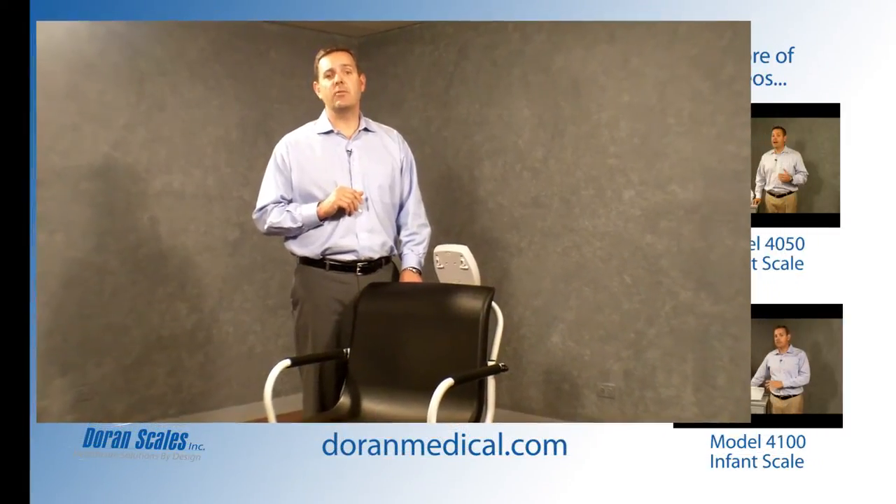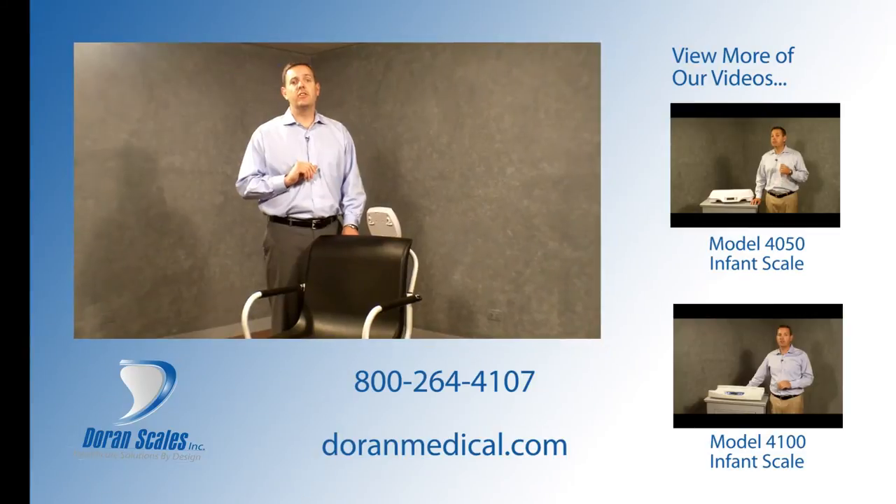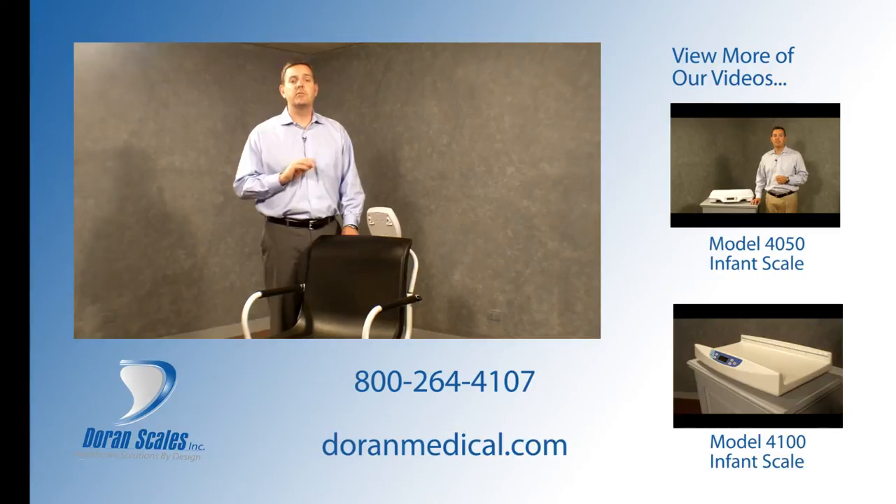Thank you for your interest in the Doran Model DS8150 chair scale. As with all Doran Medical scales, you can expect many years of performance from the DS8150, backed by a two-year warranty. To request a price quote for this scale or to view our full line of medical scales, please visit DoranMedical.com.